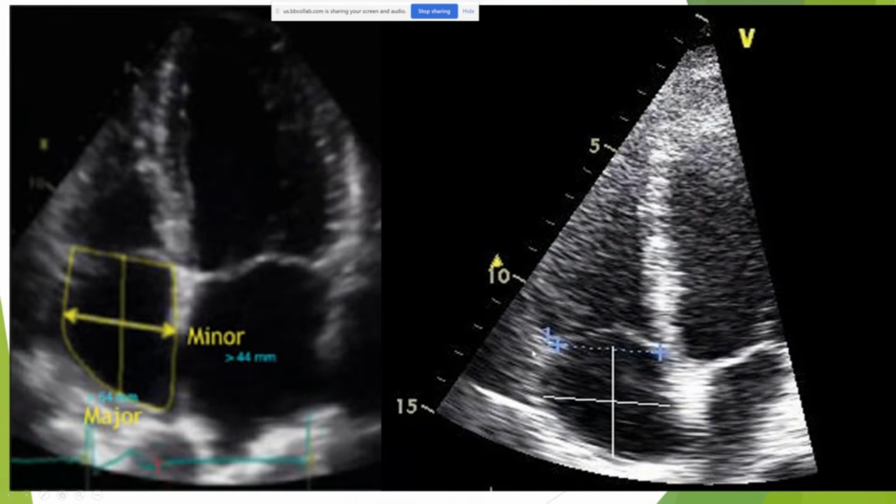This is to assess the right atrium. We do it in the apical four-chamber, and it helps us estimate the right atrial area via this planimetry, which again is a tracing. The first thing we're going to do is get the maximum long distance of the RA from the center of the tricuspid valve annulus right here, and then we trace that all the way down.